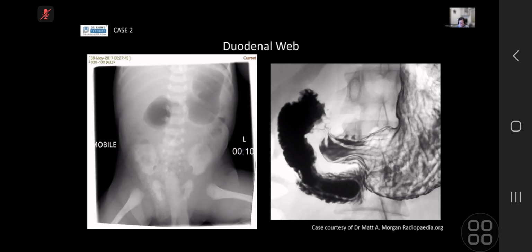Thanks, Toby. Yes, sorry, so I did lie. I use Omnipaque 350 for my upper GI studies, but for my lower GI, I always use Gastrografin diluted, 100 to 150. So yes, it's a diluted form of iodinated contrast, water-soluble. There are people who say that if you really struggle to see the DJ flexure and you just want nicer pictures, but you know that it's normal, not a malrotated study, after your water-soluble contrast you can give barium. But that's what people say. I don't do it, and I think Toby probably doesn't either.